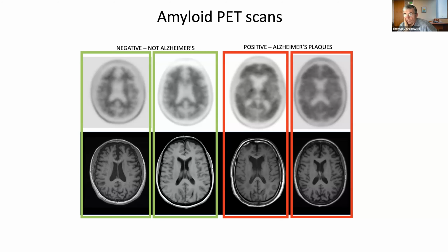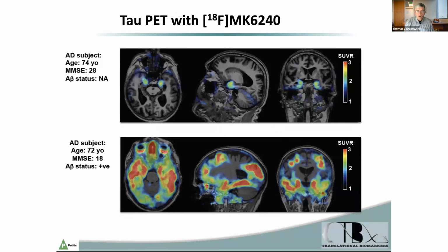clinically. And you can also measure this quantitatively, but a visual read is, at least in the clinical realm, all you need, because by the time someone comes in with amnestic mild cognitive impairment, it looks like these scans on the right. It's not a close call. Tau ligands show a more variable uptake, but tend to correlate pretty closely to the clinical variability that we observe.